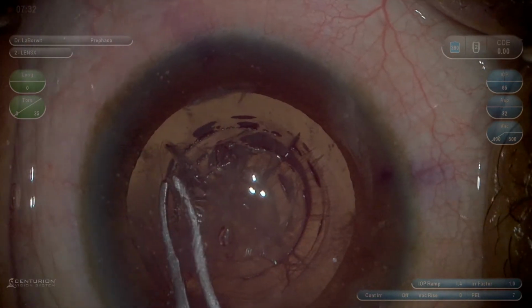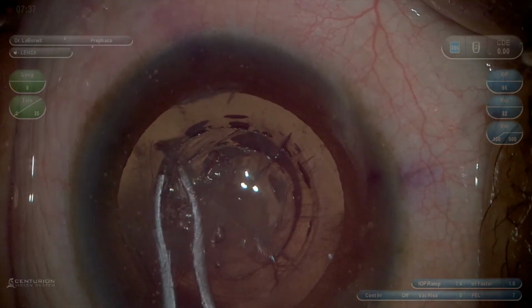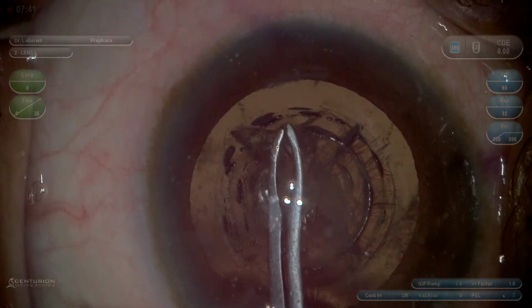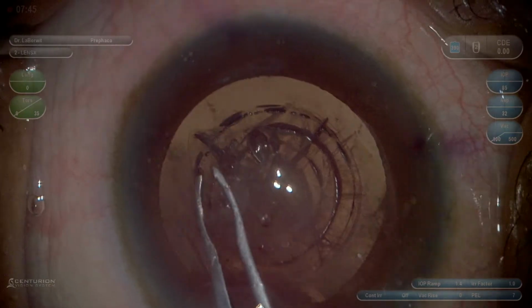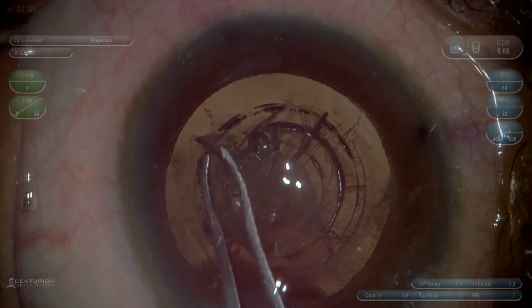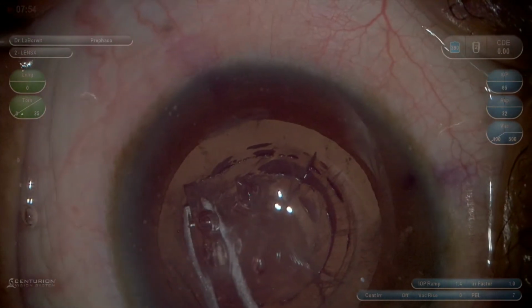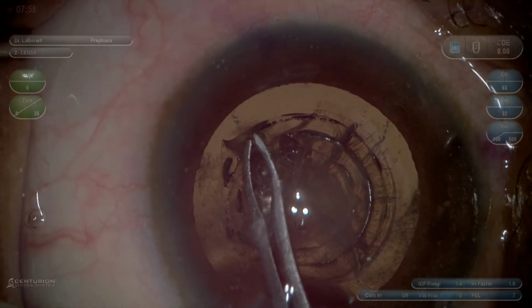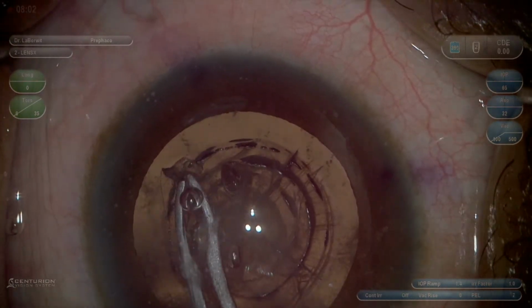Trying to grab the capsule, the red reflex isn't great because of the cut cortex, the 24 cuts in the lens, and as I'm trying to use almost tactile efforts to grab the anterior capsule and go in a clockwise manner, you can see I really just don't have much success. I'm even using the tips and tilting them. I started to distort the cornea a little in this case, and I'm very careful to make sure that I'm maximizing my visualization.